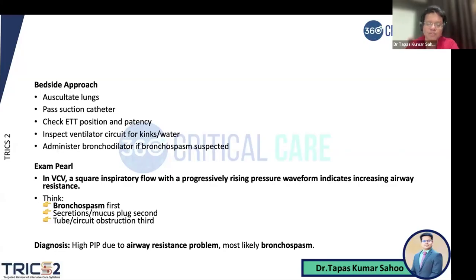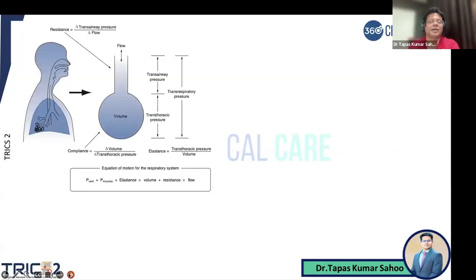So the examiner would be very keen to know how you are dealing with sudden ventilatory trouble that appears in the patient. Okay. Now this is some conceptual thing. I'm not again going into detail.